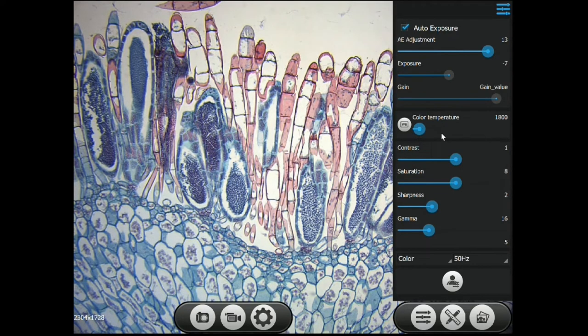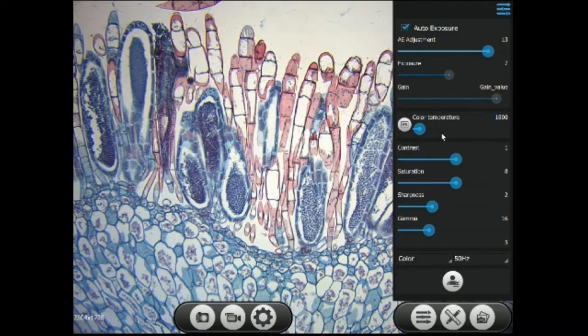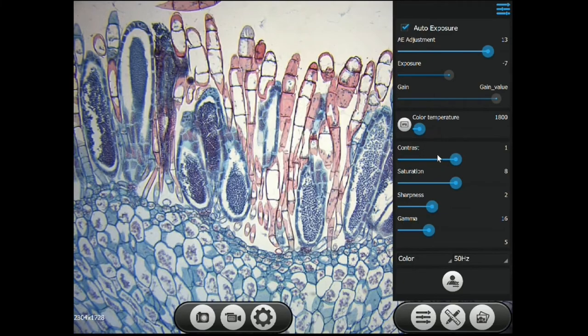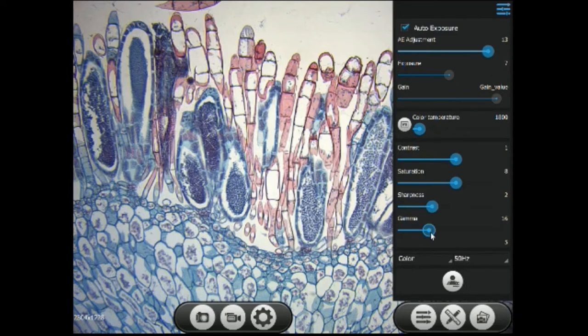White balance an image. Move to a part of the screen that is completely white and hit the button labeled WB. Below are the camera settings. You can change them if you like, but we recommend leaving them at default values.